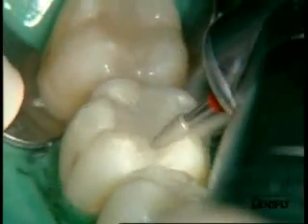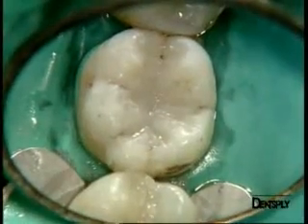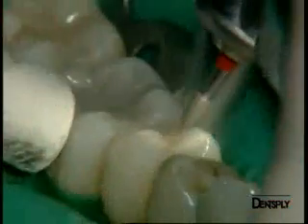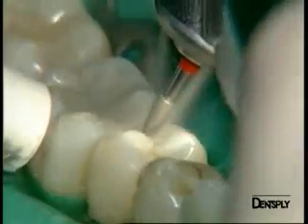We finish here by creating the mesioproximal pits. You can see on the occlusal view the anatomy obtained under these conditions. We do the same for the premolar, where we are careful to preserve the convexity of the marginal crest.